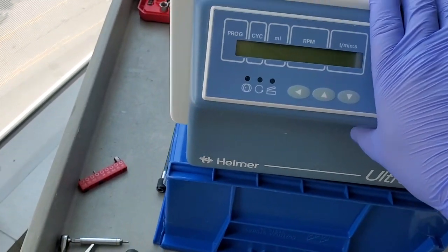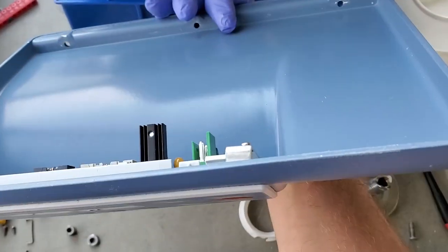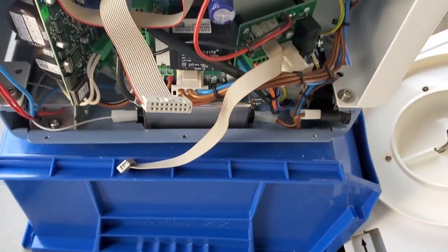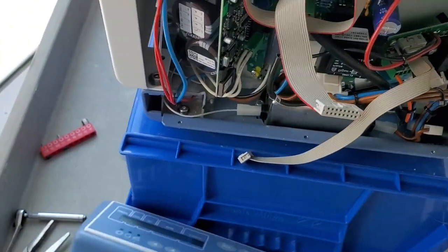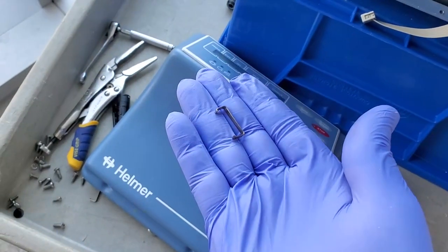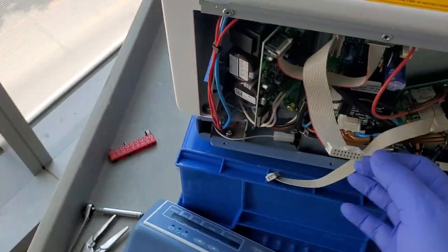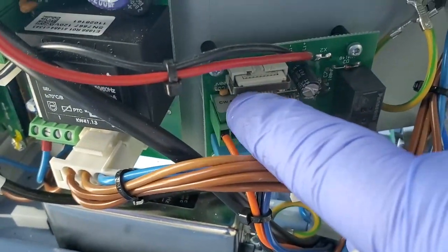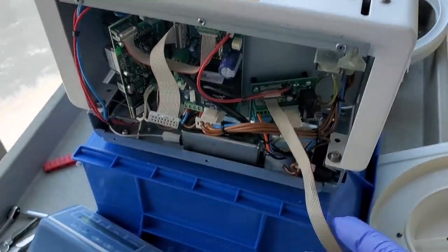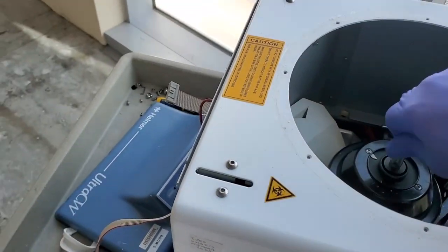The front control panel has three metric allen fasteners underneath and then it comes off. Mind you, there are two ribbon cables on the back side with keeper springs retaining them — very easy to remove with a small flat-head screwdriver. You can see right here the keeper spring holding this connector on.